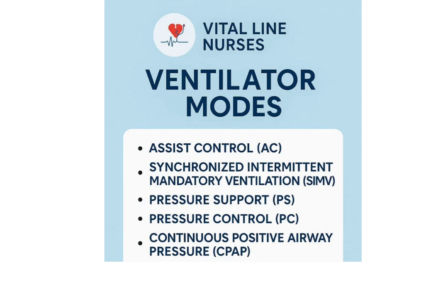3. CPAP, continuous positive airway pressure. In CPAP mode, the patient breathes completely on their own. The ventilator provides continuous pressure to keep the airways open, but it doesn't deliver any breaths. This is often used when a patient is ready to breathe independently.